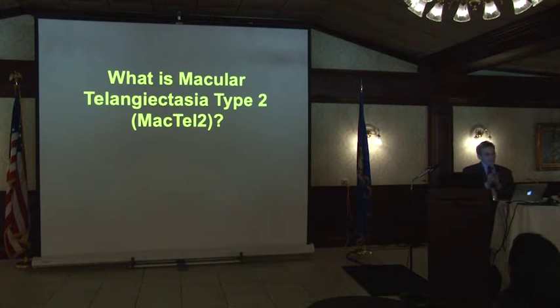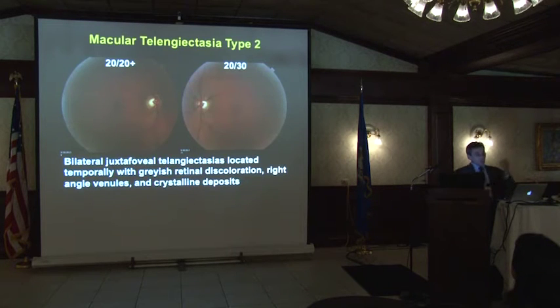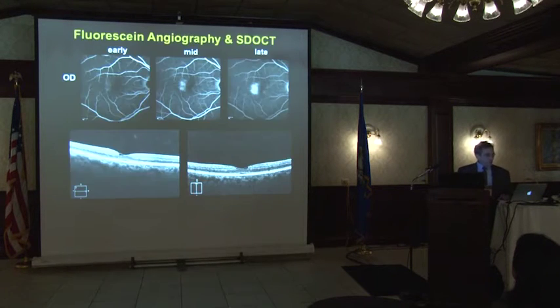And the best disease to look at with the small area imaging is a condition that we thought was pretty rare, called Macular Telangiectasia Type 2. But it turns out it's just not that rare. For those of you in the audience, for the residents in particular, this is a fascinating disease. I don't think you can see it too well, but it's a disease that starts on the temporal edge of the fovea, and you can see it by abnormal vasculature. And fluorescein shows you this abnormal vasculature by leakage here.